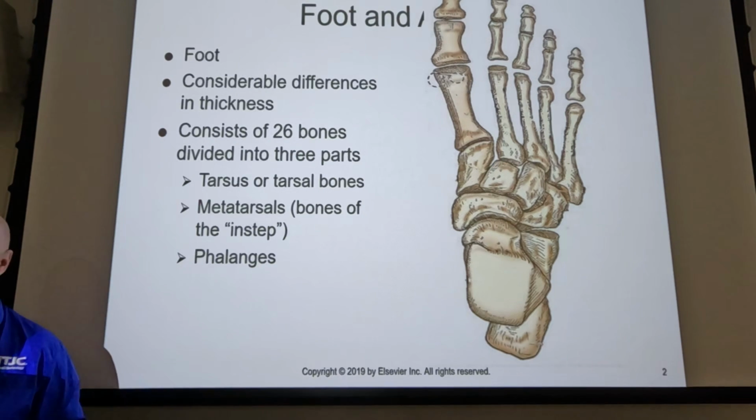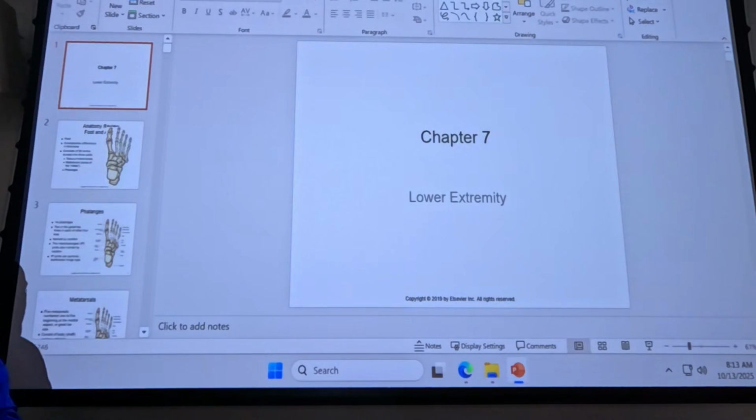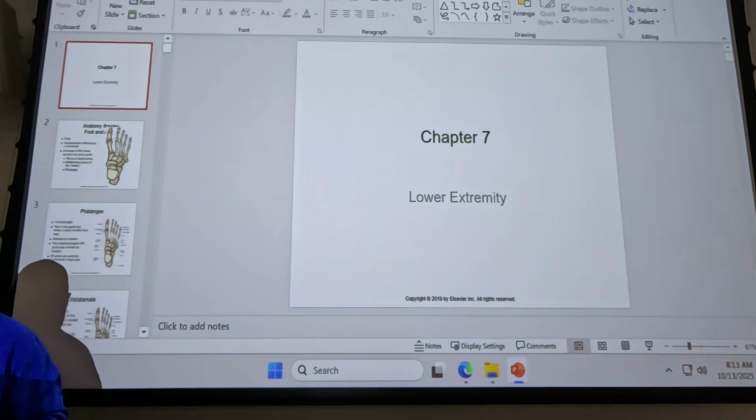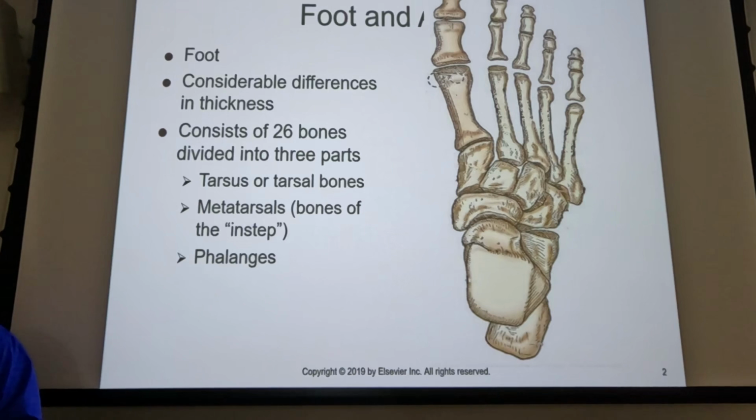So that presented imaging challenges that just don't really exist anymore. We used to use those on lateral C-spines, AP T-spines, things like that. And we just don't need them anymore. But you may see reference to that. We needed a challenge this morning. But it is not as much of an imaging challenge as what it once was. So you may see a reference to it on the registry, and that's what it's talking about: a compensating filter compensates for tissue density differences. It's just a chunk of aluminum in a wedge shape in a lot of cases.